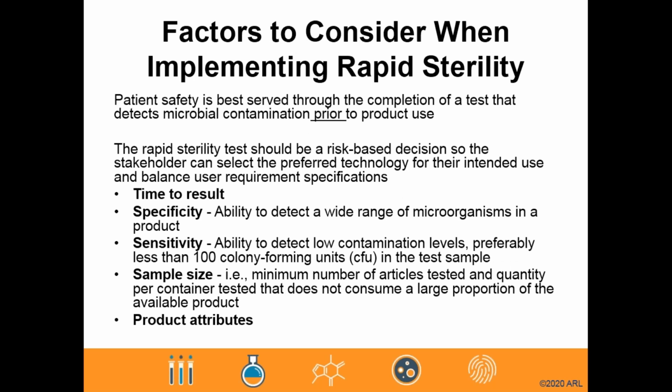The next slides cover some important things to consider when deciding if rapid sterility testing is right for you. First and foremost, it is important to always remember that patient safety is best served by detecting microbial contamination prior to a product's administration. In order to decide if rapid sterility testing is right for you, and further, what methodology meets your needs, several factors play into this risk-based decision. This includes time to result. As mentioned previously, methods which do not require a growth step offer the fastest turnaround time. If time to result is the most important factor, looking into one of these may be your best option.